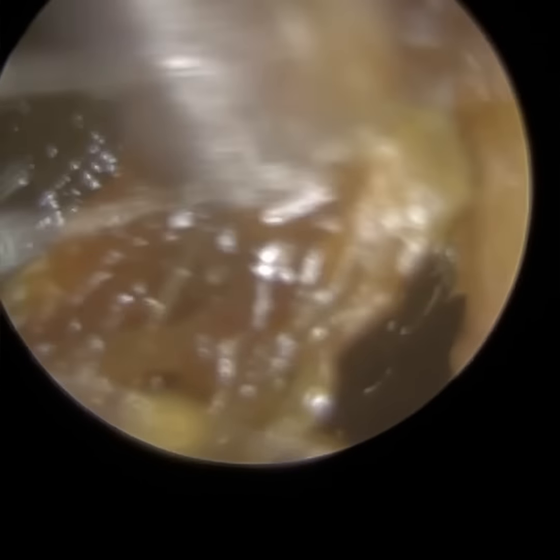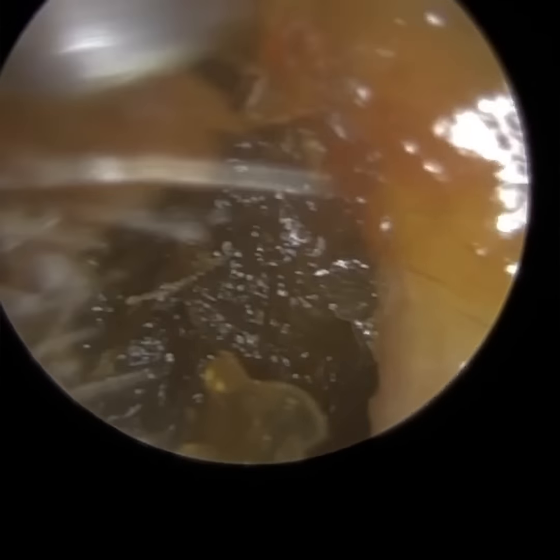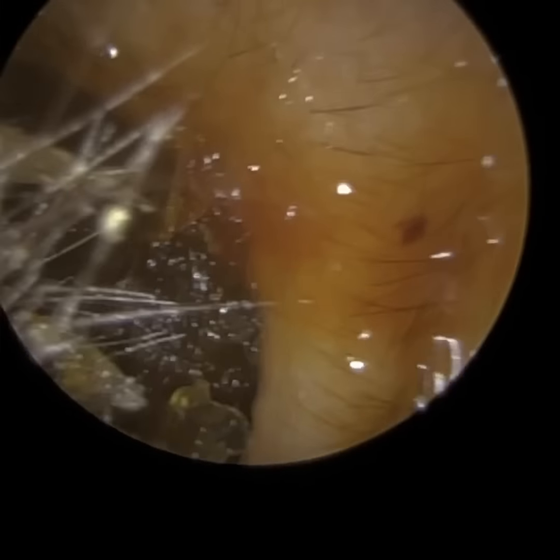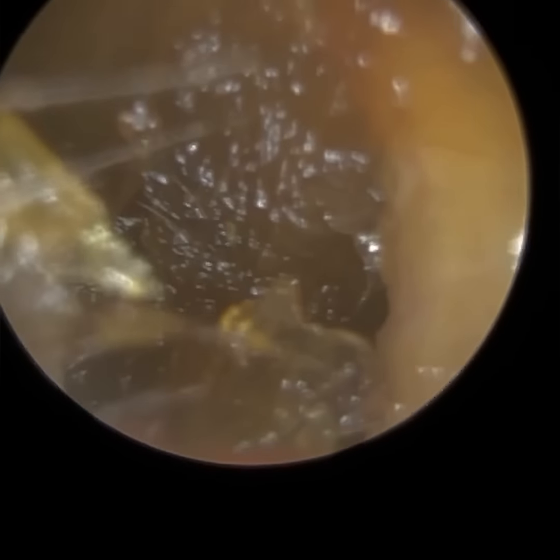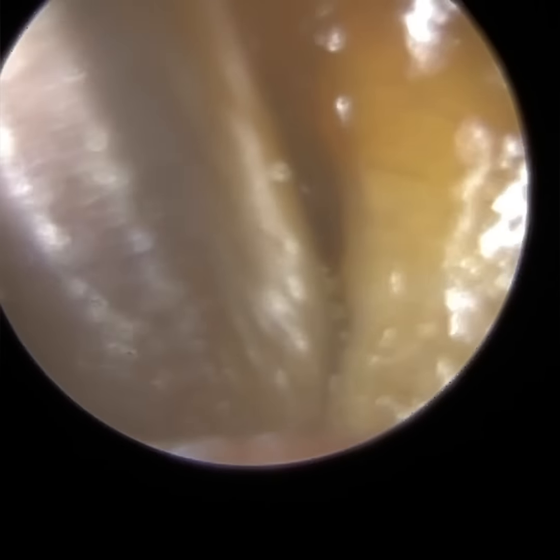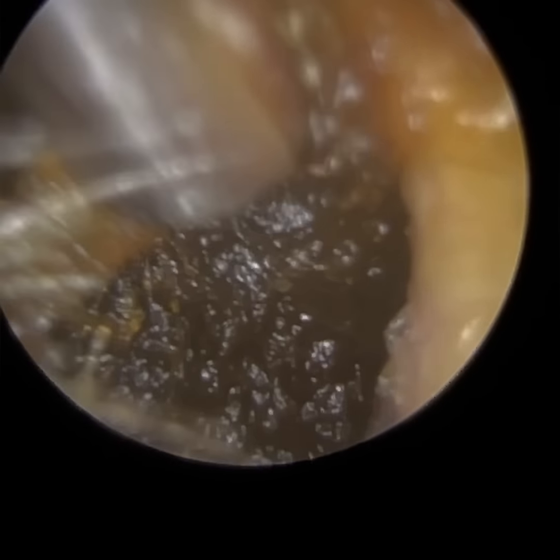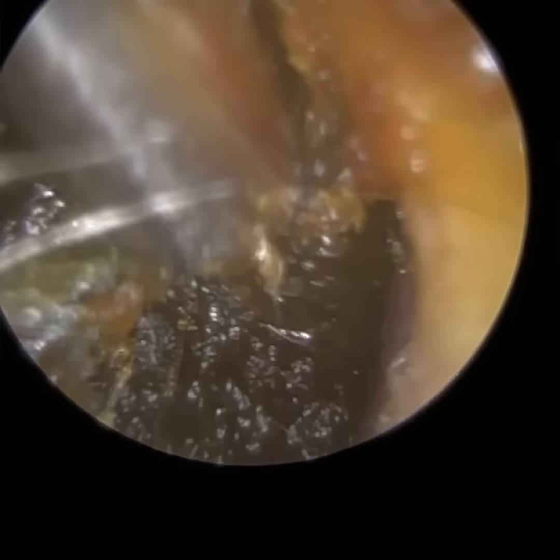So patient one — we're just treating this right here. As you can see, the lateral aspect of their wax is quite sticky and glue-like. What I'm having to do is use the endoscope to enter the ear and then push open the ear canal ajar, because the entrance of this patient's ear canal is quite narrow, and this wax plug is significantly broader and wider than the entrance.